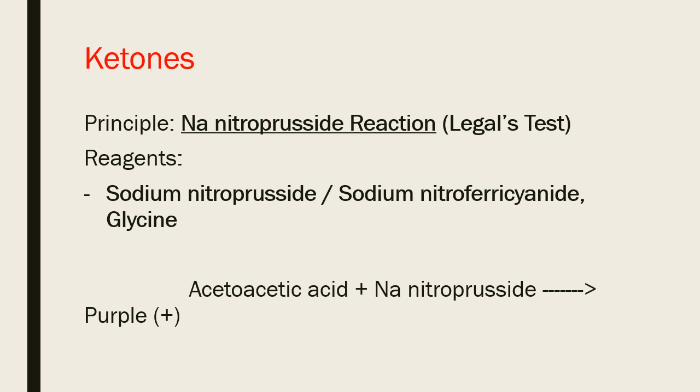Your ketones. The principle for your ketones is the sodium nitroprusside reaction, otherwise known as your Legal's test. For your Legal's test, in your ketones, you have your sodium nitroprusside and glycine. Okay, and so you have as such.